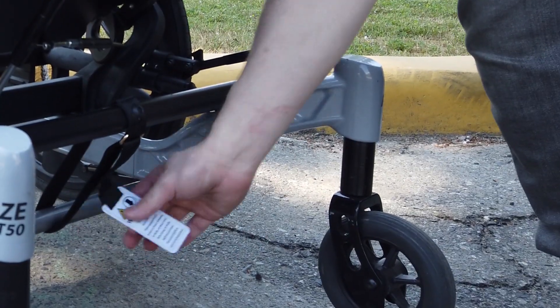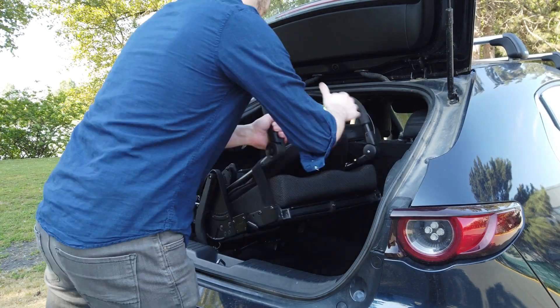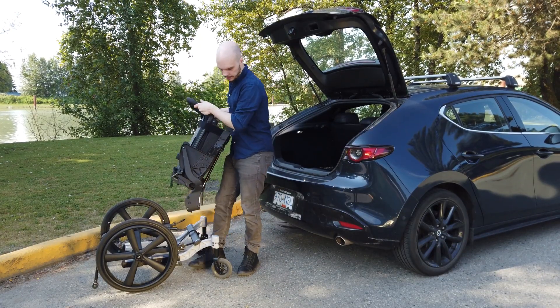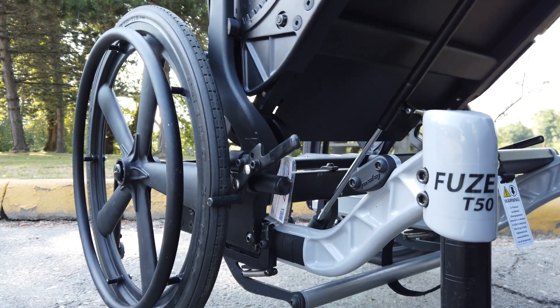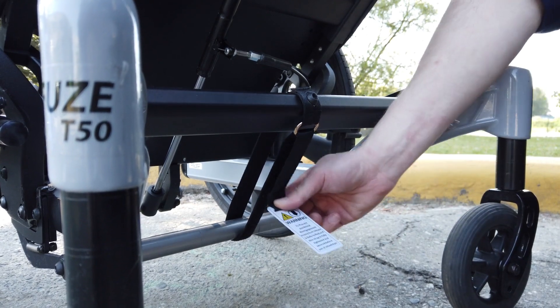Ensure the locking strap is fully loosened. Lift the upper frame by the backrest posts or push bar and align the locking mechanism located on the lower frame with the locking plates located on the upper frame. When the frame is correctly installed, there should be an audible click.